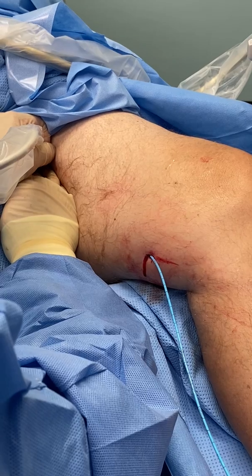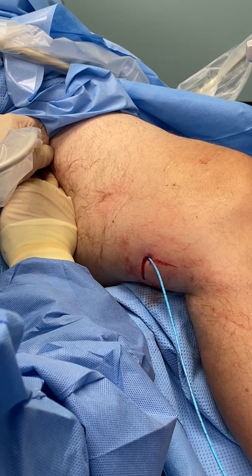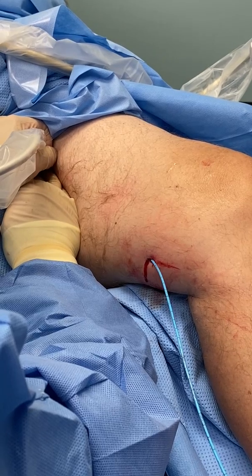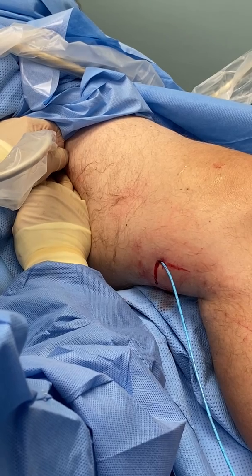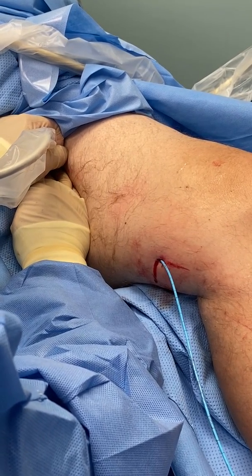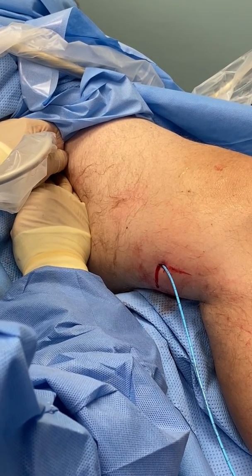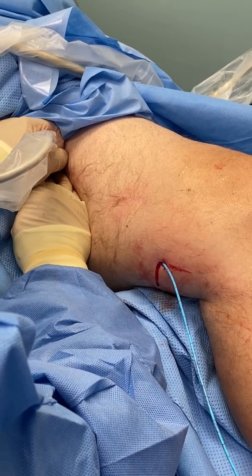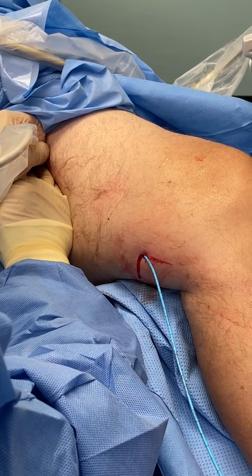So this is considered, again, an evolution in the treatment of great saphenous veins and short saphenous veins. The adhesive was invented a while back by an interventional radiologist. Medical adhesives are used for a lot of different things in medicine — they can be used to close aneurysms. Everybody knows about glue for suturing wounds, and some of these glues are now being extended into other novel utilizations.